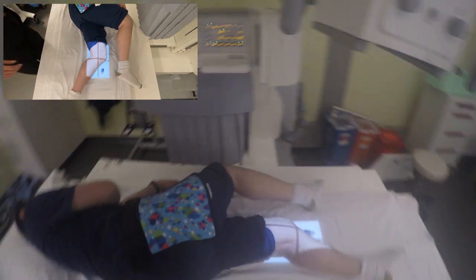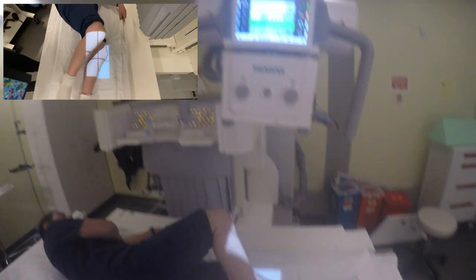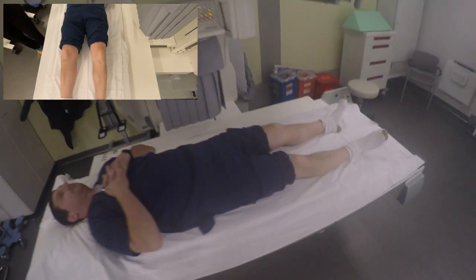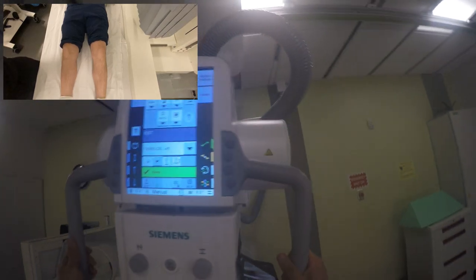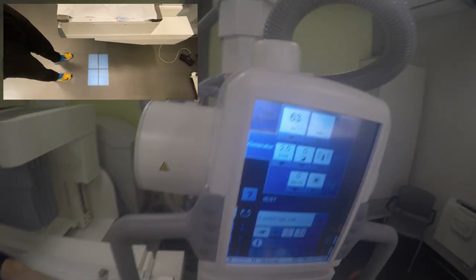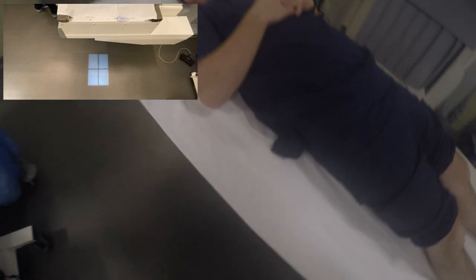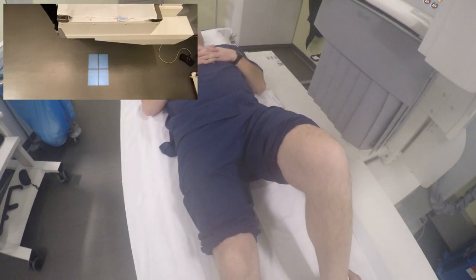They also want to see your kneecap, your patella. So I'll have you roll all the way onto your back again, please. In a moment you're actually going to help me on this one. Let's bend your left knee up — right there, a little too much, come down right there, there you go.